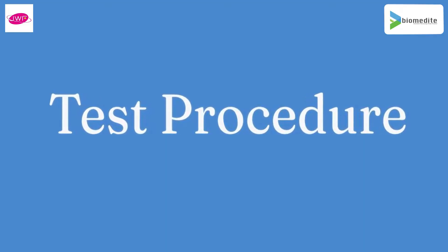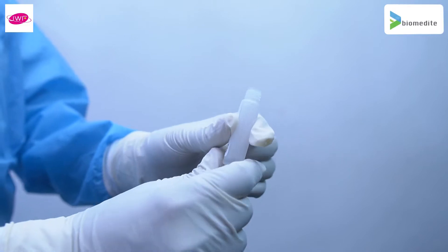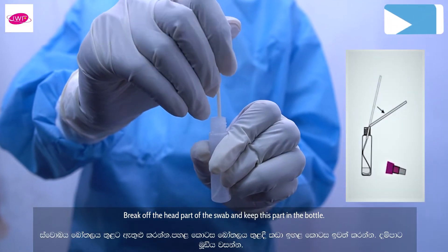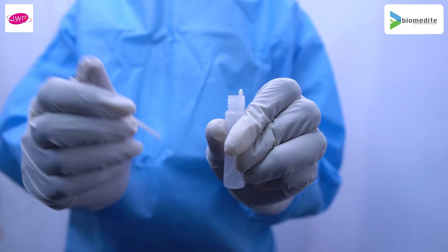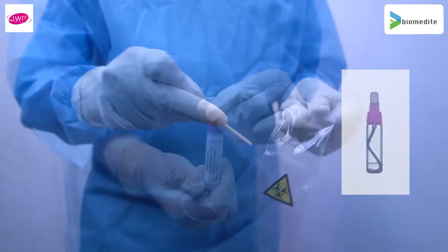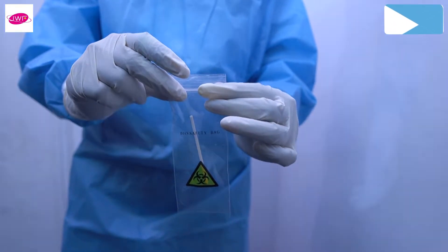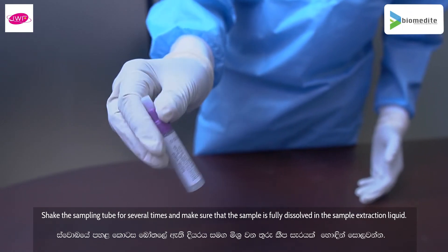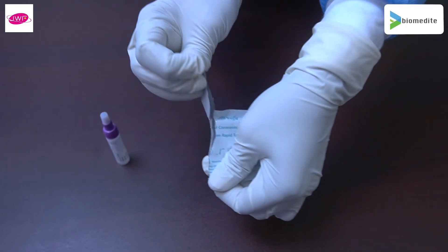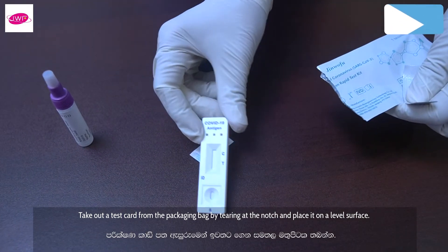Test procedure: after sample collection, remove the screw cap. Break off the head part of the swab and keep this part in the bottle. Shake the sampling tube several times and make sure that the sample is fully dissolved in the sample extraction liquid. Take out a test card from the packaging bag by tearing at the notch and place it on a level surface.